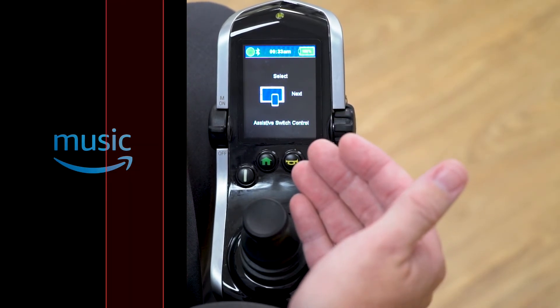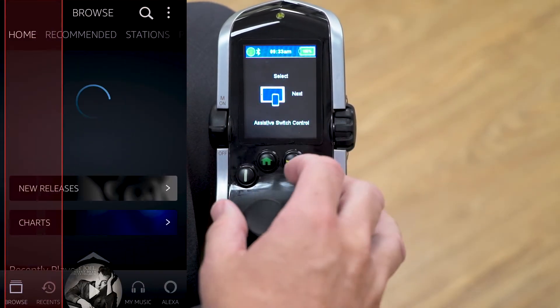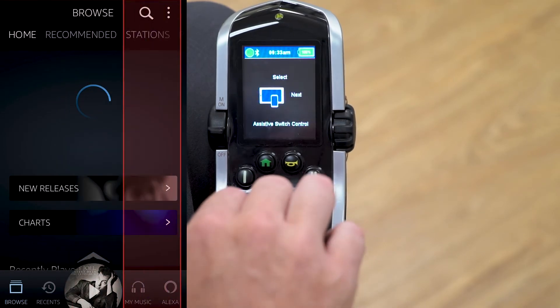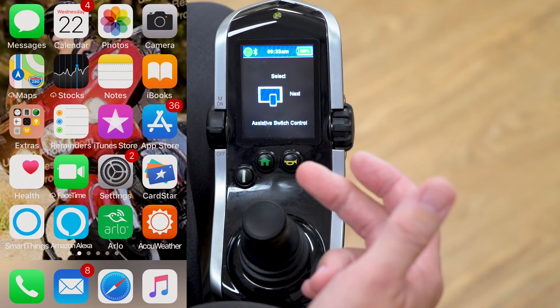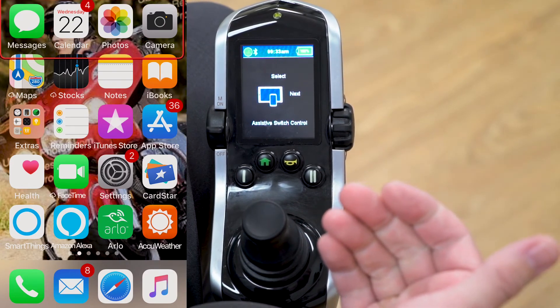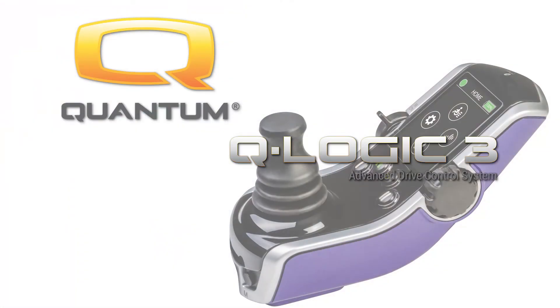That is the easiest way to pair to your Apple device in a very basic format. To leave an app, give a reverse command. To go back to the home screen, give another reverse command. Those are the steps to pairing the Q-Logic 3 system to an iPhone or an iPad. If you have any questions, please contact your local Quantum representative or our technical support department.